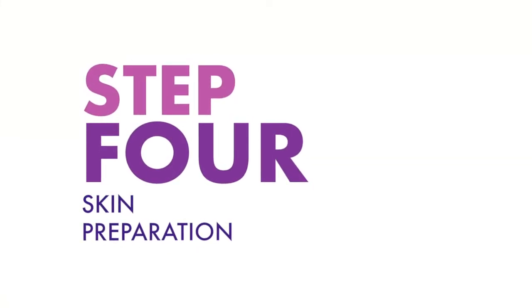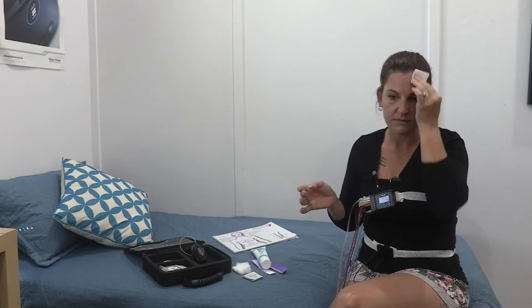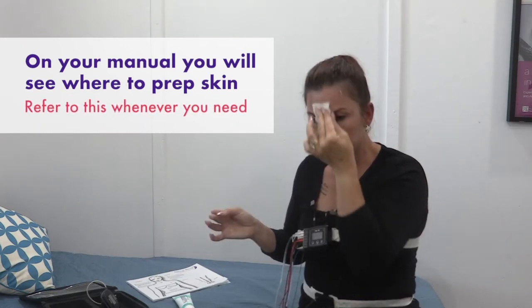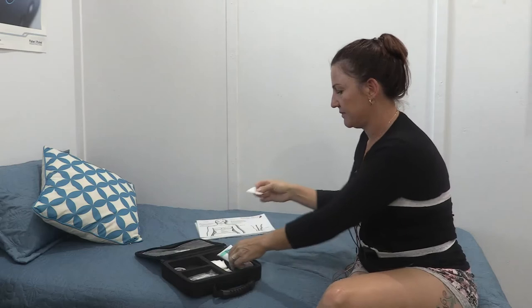Step four: skin preparation. Skin prep is very important for a successful study. We need to remove all dead skin, oil, sweat and dirt to ensure good electrode contact and signal strength. On your manual, you will see where you need to prep your skin and you can refer to this whenever you need to. There will be several locations on your face, behind the ears, chest and dominant leg, but let's just start with your face.